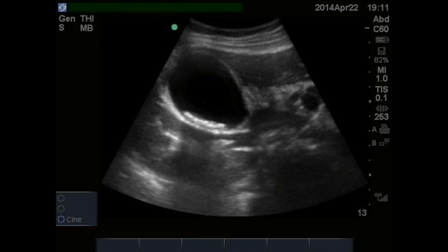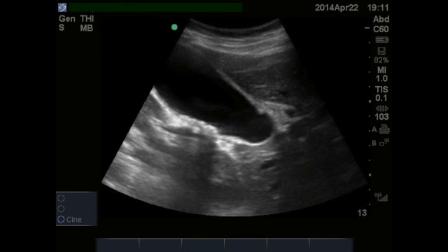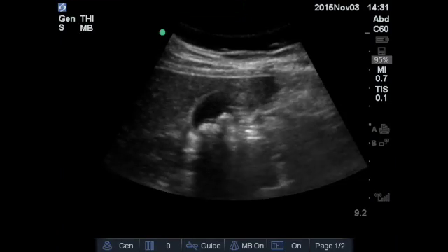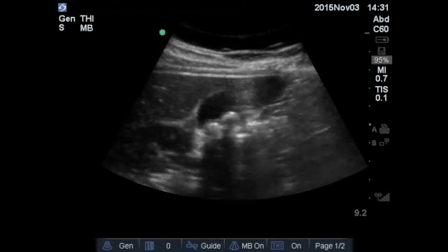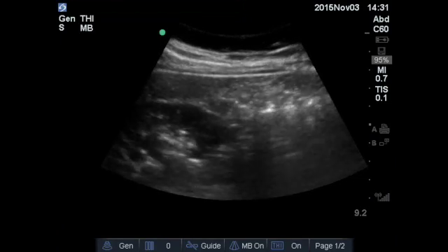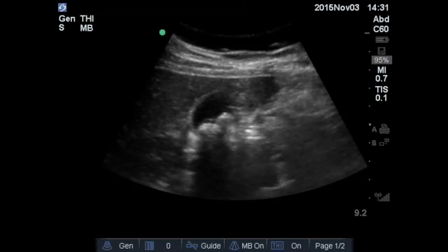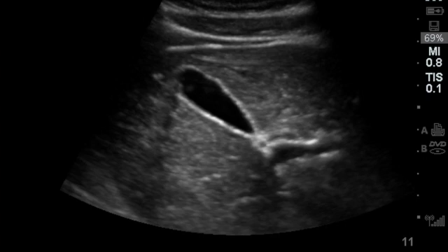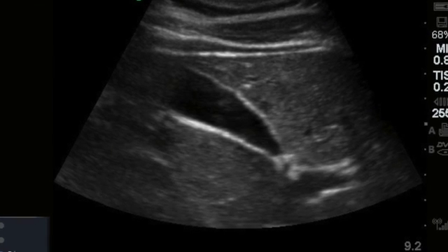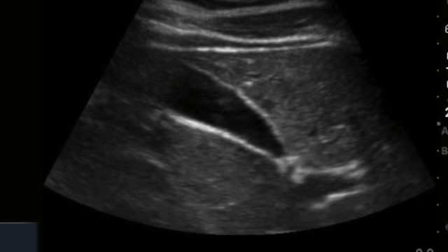If you see this, your job can be done. If the clinical suspicion is high and you see gallstones, you may move on to order a comprehensive radiology-performed ultrasound or call your surgeon. On the other hand, if you don't see any gallstones and the patient has normal liver function tests, a biliary cause of pain is very unlikely.